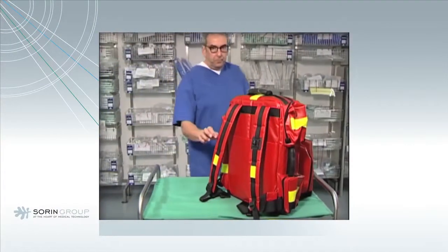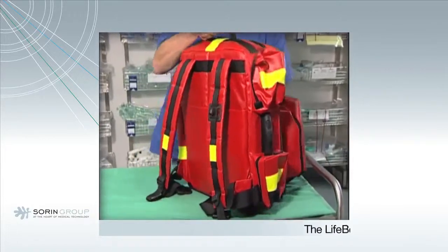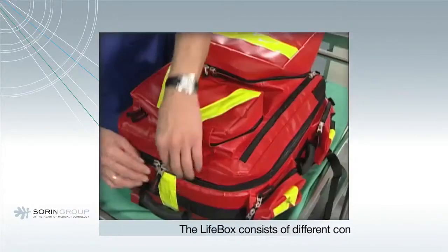The LifeBox consists of different components. In the backpack, components are stored to be transported to the patient in need.